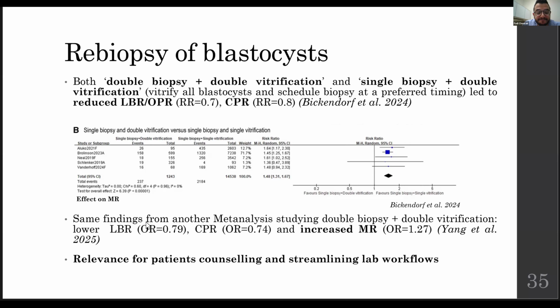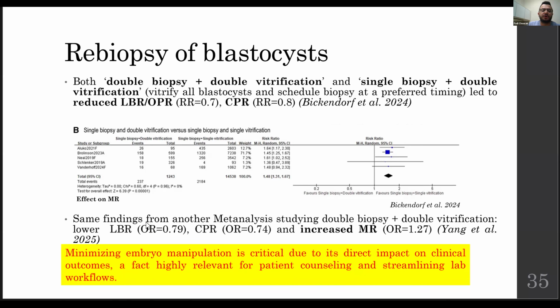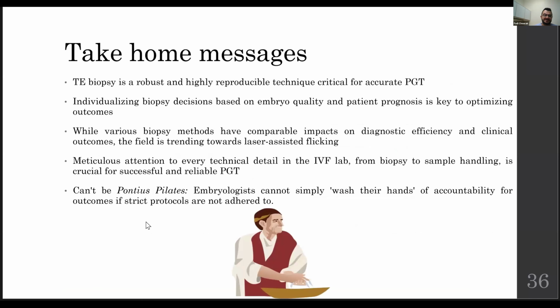Why is this data interesting? It's relevant for patient counseling and for streamlining lab workflows. So minimizing embryo manipulation is critical due to its direct impact on clinical outcomes, a fact highly relevant for patient counseling and streamlining lab workflows. Take-home messages.